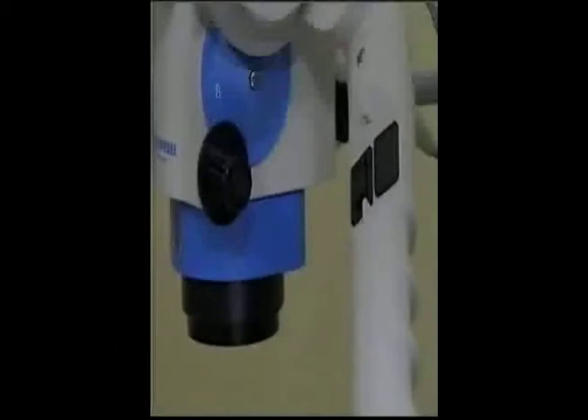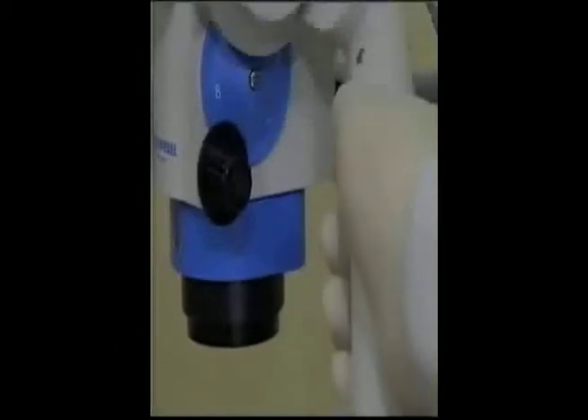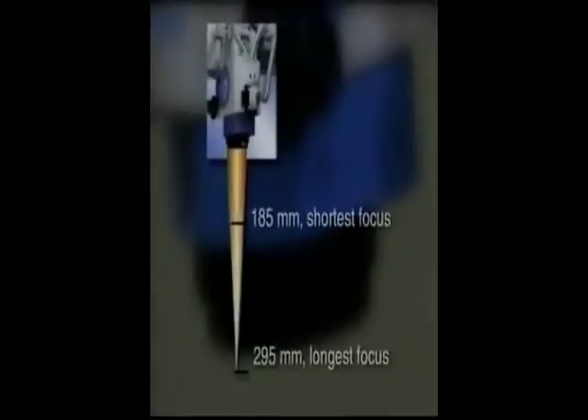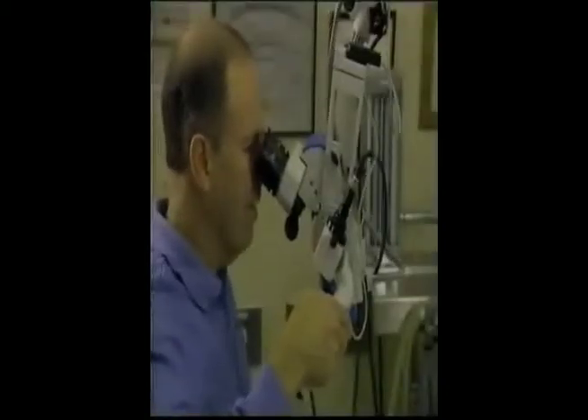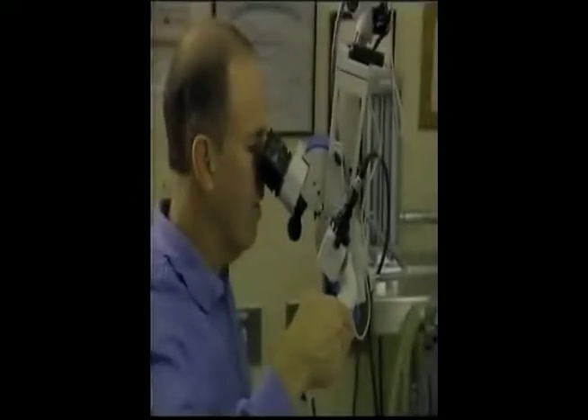By far the most significant feature, and one that has captured the imagination of virtually every clinician that has used it, is Molar's exclusive electronic variable focus. With this exclusive feature, you can operate comfortably at a working distance of up to almost 300 millimeters and be assured that the operating area will remain in sharp focus over a 10 millimeter range. Clinicians who have experienced the ease of electronic variable focus do not want to even consider using other microscopes without this feature.